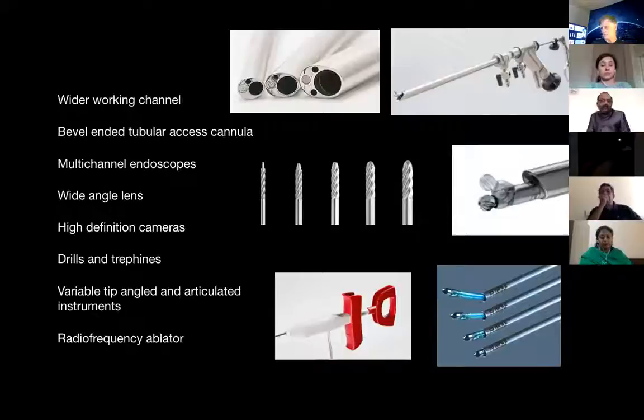They've all made the surgery quite successful. And the last one, the radio frequency ablation, is a nice one to do. There is no need to use bipolar. We can use this radio frequency ablator to cauterize. I will show it in my video.